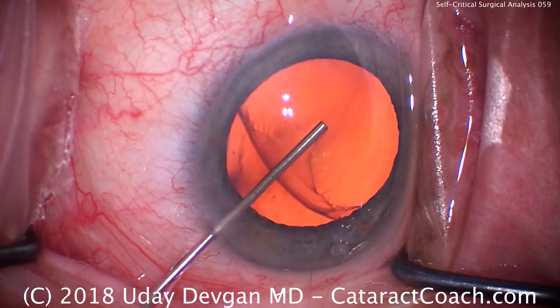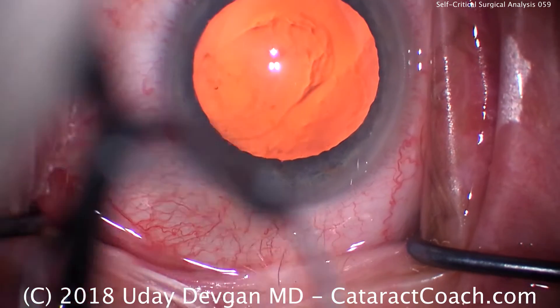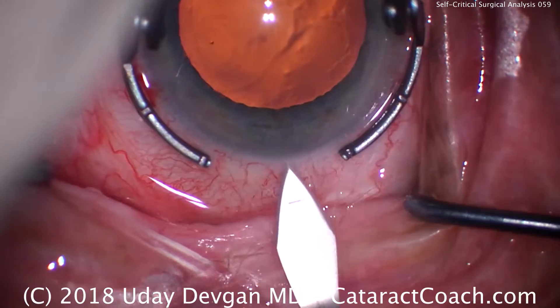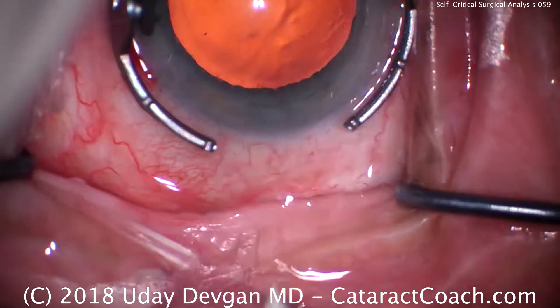Fill the eye with viscoelastic. Now you see right there we're going to make our temporal incision. There are a few lashes that are in the way — we should be trimming those or covering them up with adhesive or tape. Here's the incision. Looks pretty good, but it's a little on the short side.